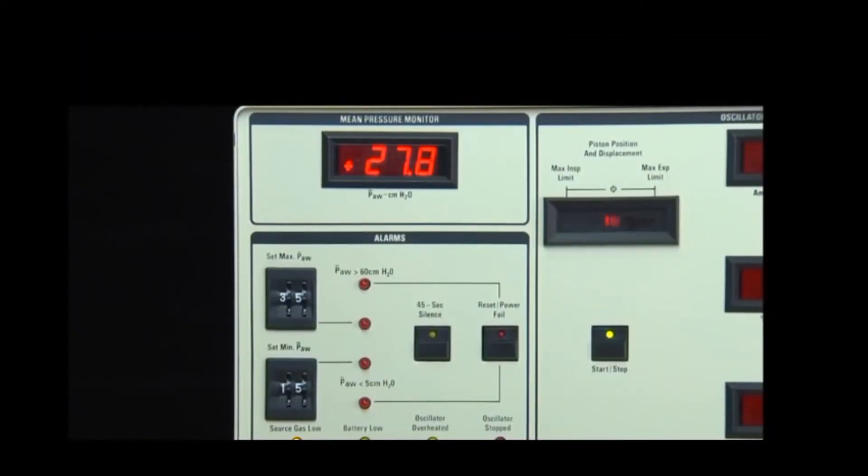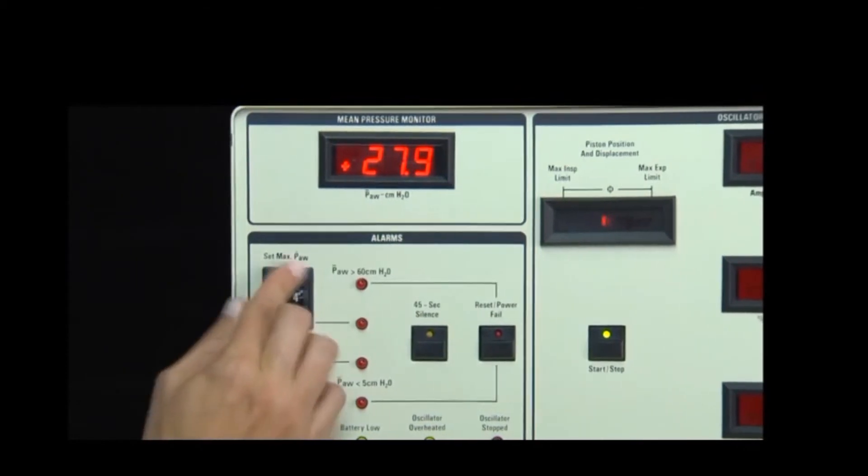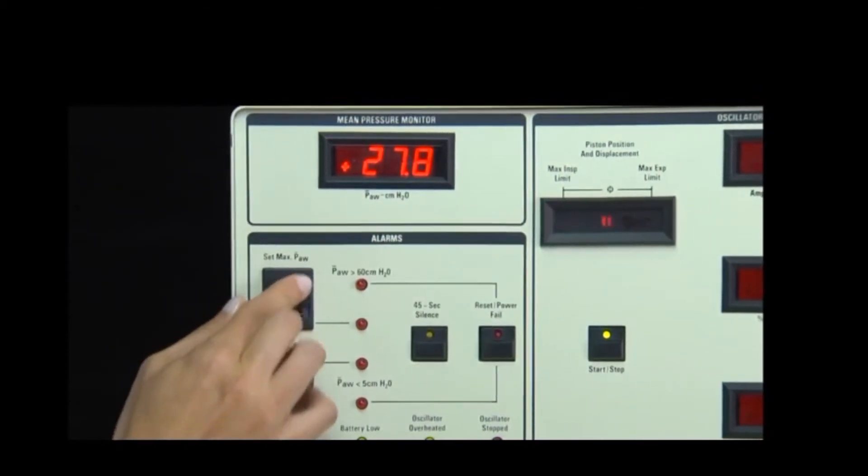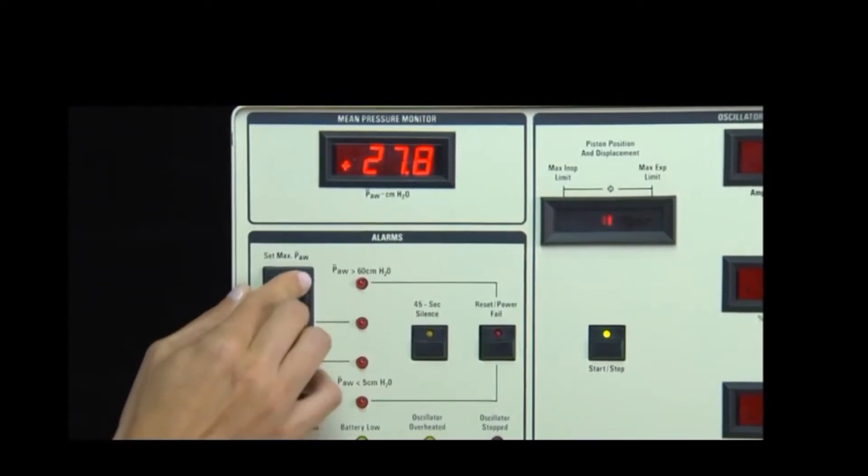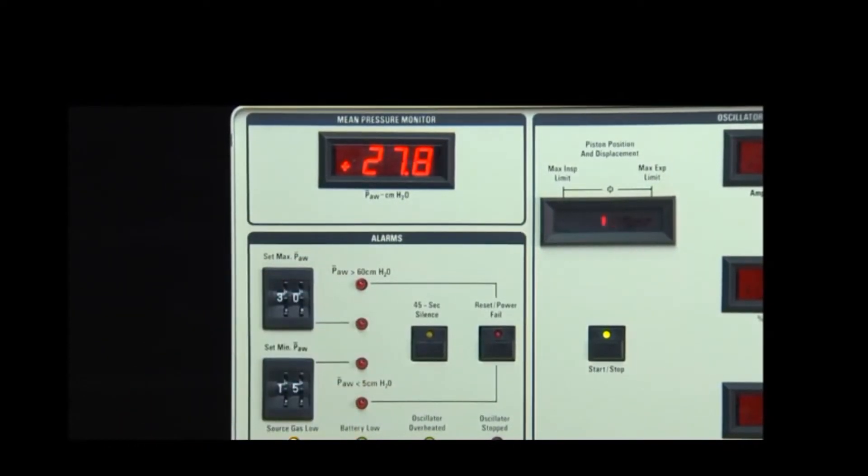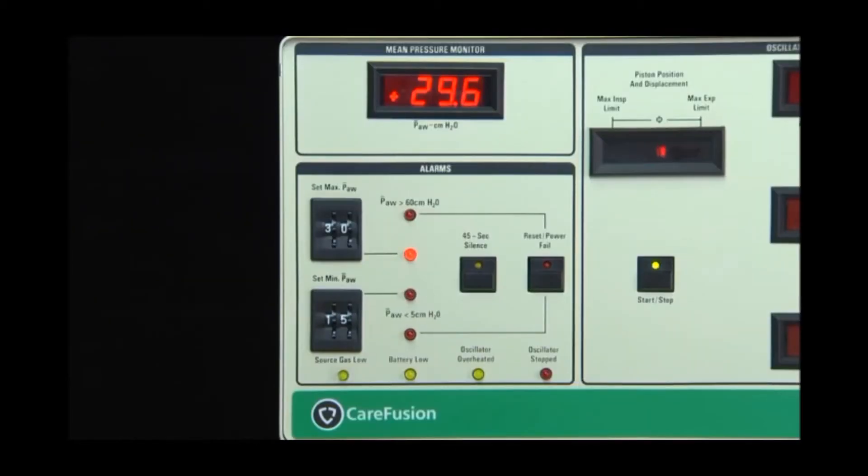Thumbwheel controls are used to adjust the set maximum and set minimum mean airway pressure alarms from 0 to 59 centimeters of water pressure. The set maximum mean airway pressure will provide an audible and visual signal when the alarm threshold has been reached. Additionally, activation of this alarm will trigger the auto-limit system. This system will briefly open the limit valve on the inspiratory limb of the circuit. The circuit pressure will fall by approximately 12 centimeters of water pressure.